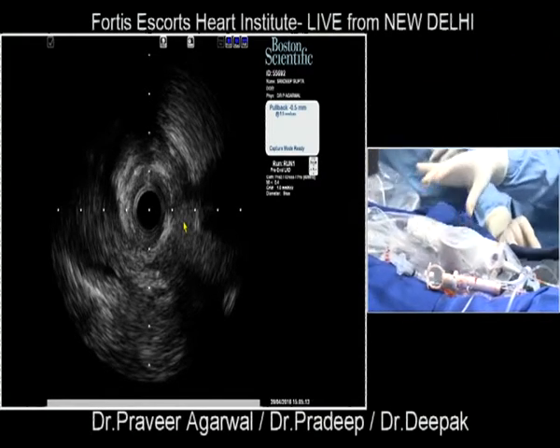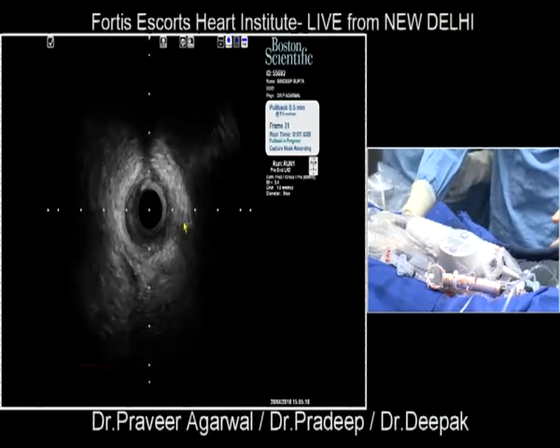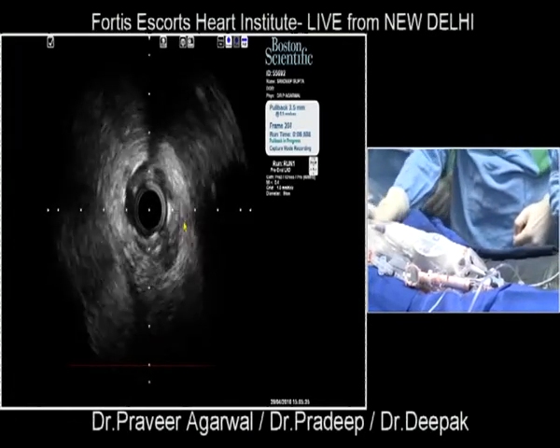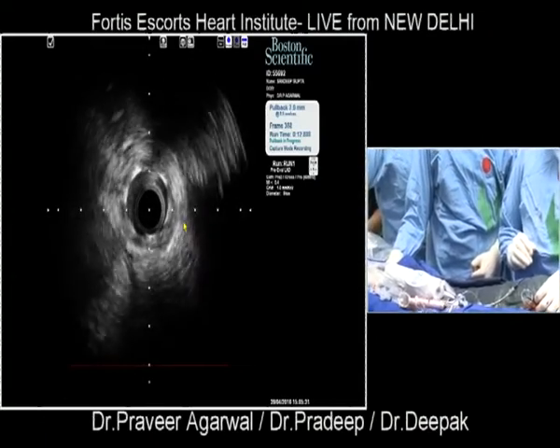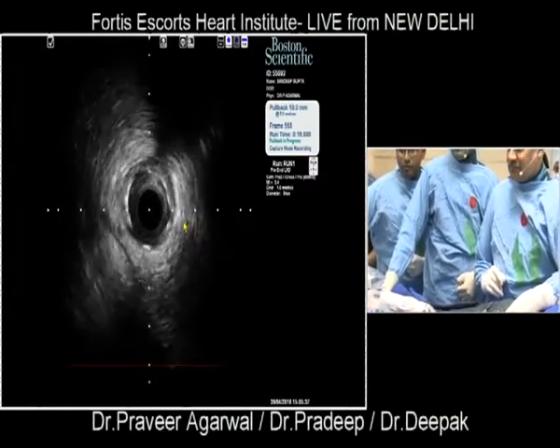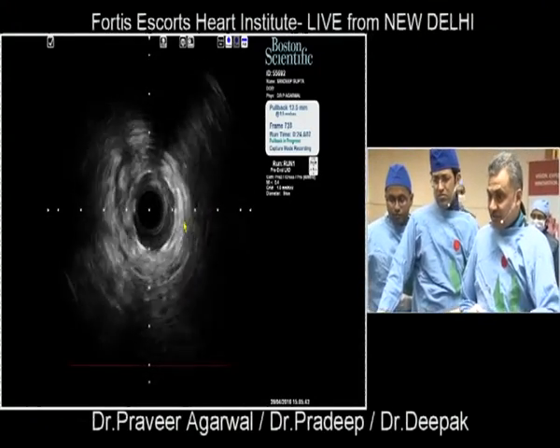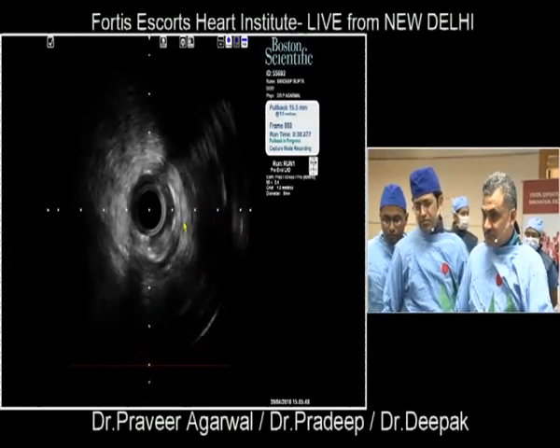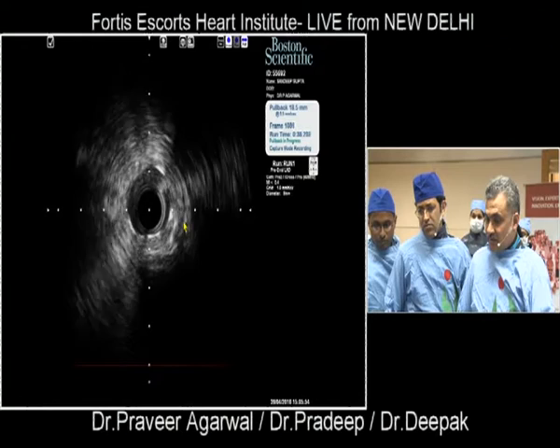Okay, start. Yep. Can you see it on screen? Yes. So you're now in the diagonal? This is the LAD. You see hardly any diameter there. Yeah, this is the distal stent. And I don't think any surgeon can grab this small vessel. It's a diseased vessel distally with less than 1.5 millimeter diameter. The previous stent shows some ingrowth.